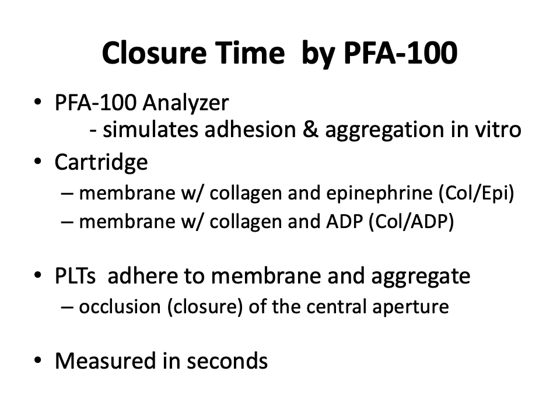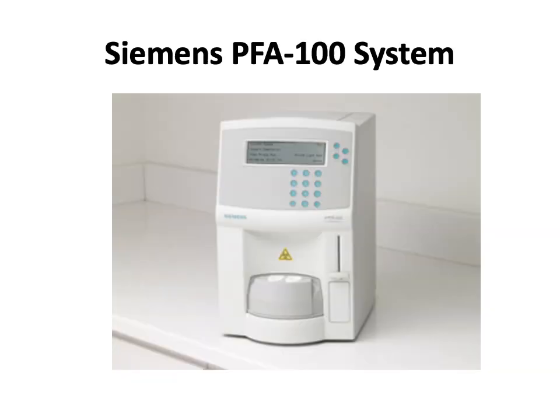Platelets from the patient's sample will adhere to the membrane and aggregate, resulting in occlusion or closure of the central aperture. The time to closure is measured in seconds. This is just a picture of the Siemens PFA-100 analyzer.